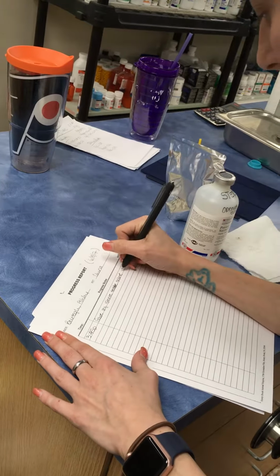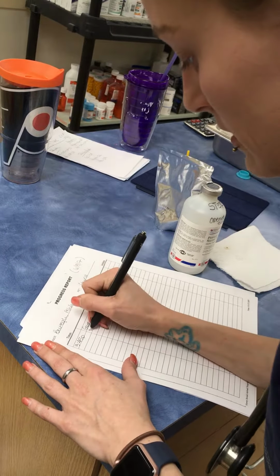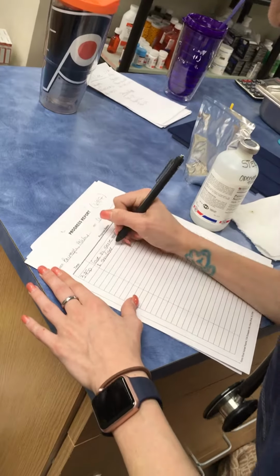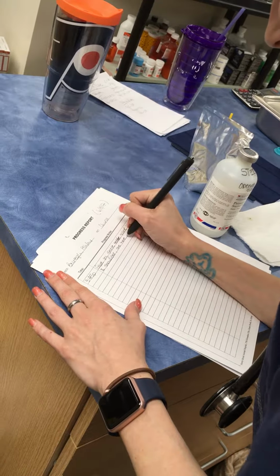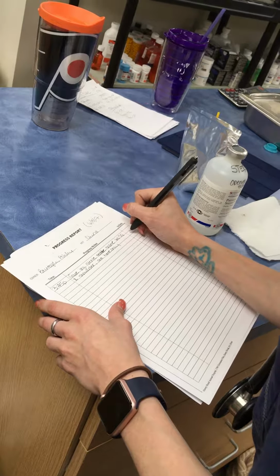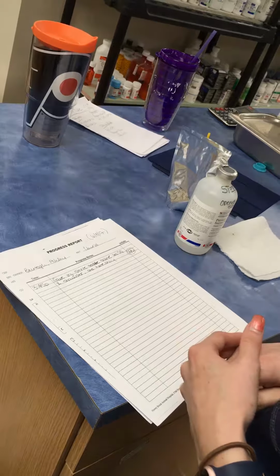Of sterile saline in the amount of 1 ml sub-Q in her right shoulder. And she will get that one time only because this is just for the simulation. Sit. And then I'll simply initial off because I'm the one that gave the injection and wrote it on the treatment sheet.